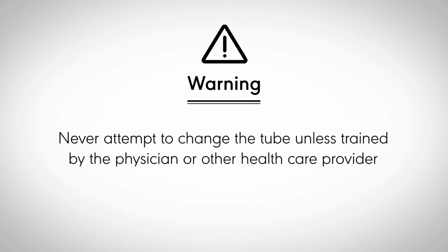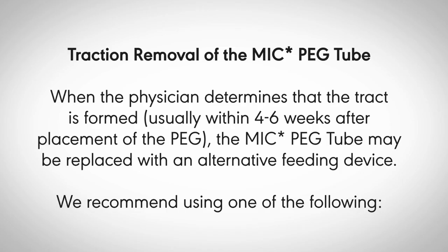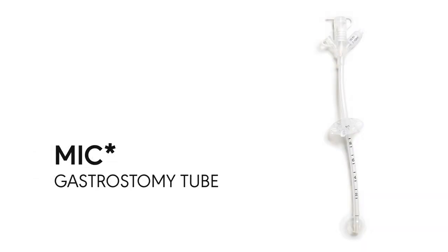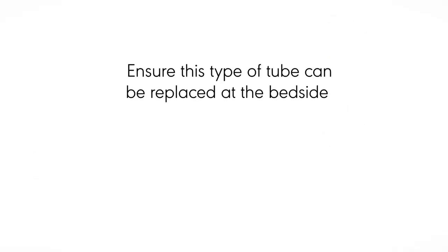Warning: never attempt to change the tube unless trained by the physician or other healthcare provider. When the physician determines that the tract is formed, usually within 4 to 6 weeks after placement of the PEG, the MIC-PEG tube may be replaced with an alternative feeding device. We recommend using one of the following: the Mickey low-profile gastrostomy tube or the MIC gastrostomy tube. Ensure this type of tube can be replaced at the bedside.